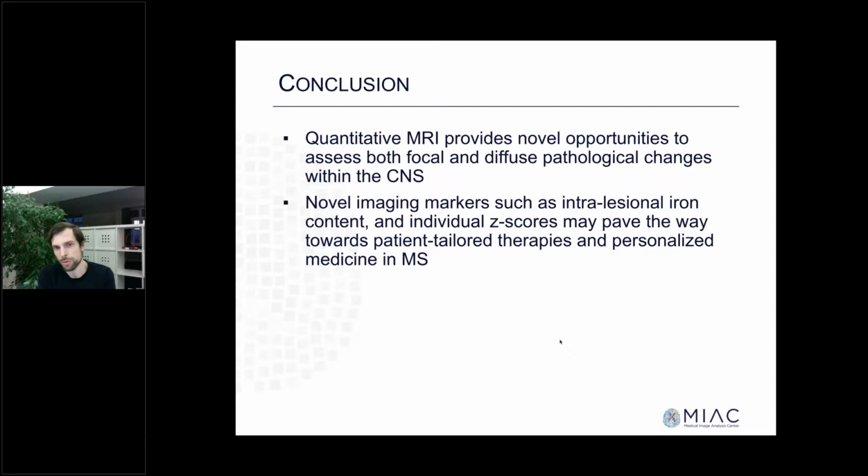I think there are two scenarios. The first scenario is you want to know about the tissue properties within a lesion. In that case, I think it's quite easy to automate because you only need the lesion maps. You can get them maybe fully automatically from a 3D FLAIR scan and apply AI-based algorithms on that to extract in the end these lesion masks, so T2 weighted lesion masks from the FLAIR images. And then you can register or co-register your quantitative sequences to the FLAIR image, use the lesion masks, and then you can make statistics on the quantitative measures within a specific lesion.